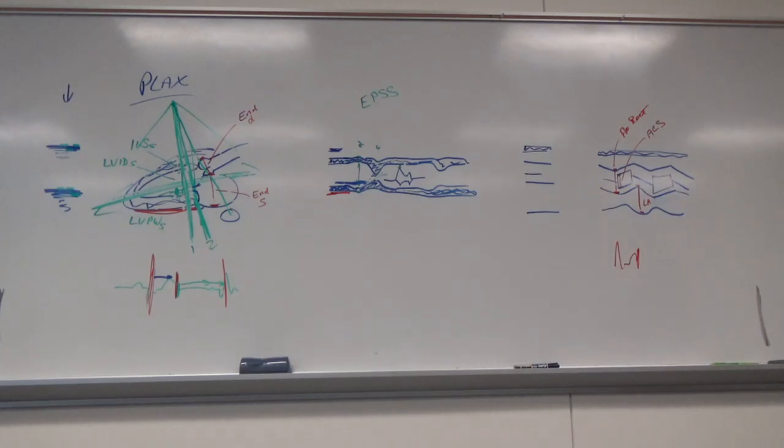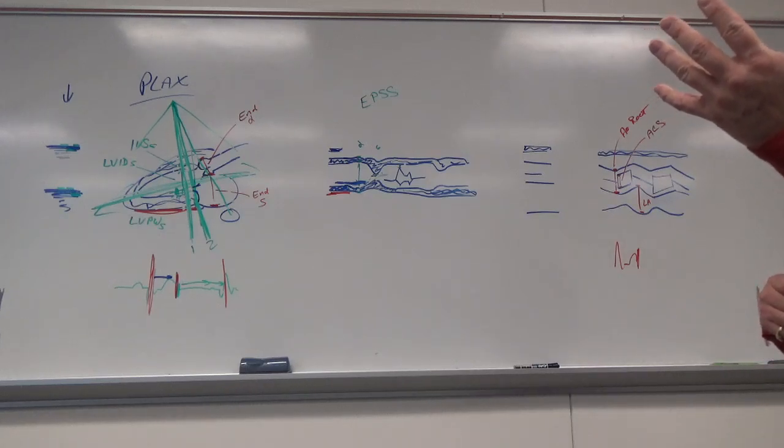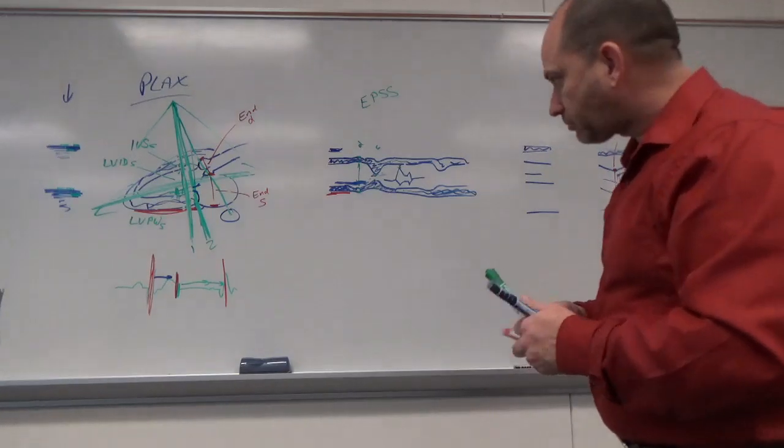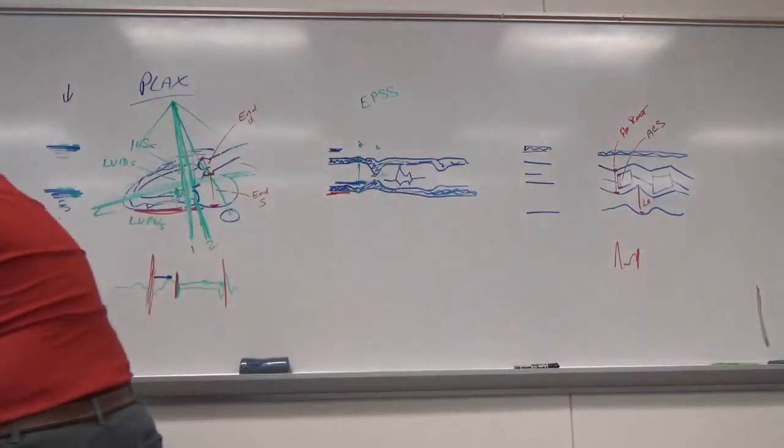What should we Doppler, do you think, on this? So we've done our clip, we've finished our measurements, and we've done our M modes in 2D. That's all we've done. What do we do next? So we do 2D, we do the measurements, we do color Doppler. Okay, so what can I do on color Doppler? Let me redraw this because it's a mess.